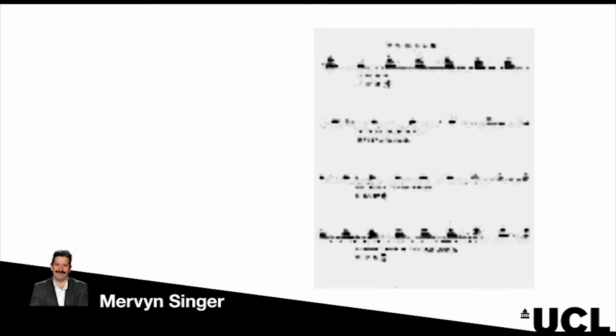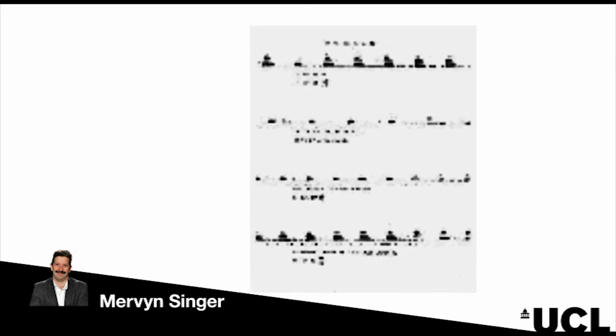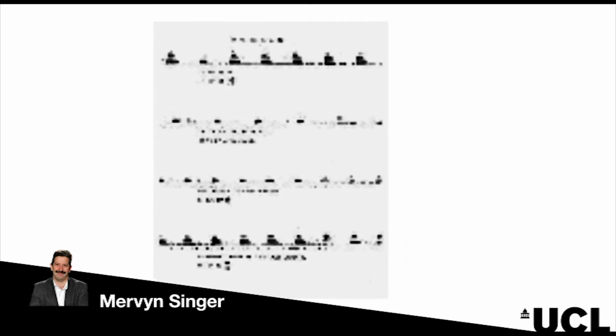It was a sort of thermal ink printer that you could print out your signals, and then you got nice waveforms, velocity time waveforms of the blood flowing through the aorta, and then you take those strips of toilet paper, as it were, when they dried, and then you could measure the area under the curve on a bit pad.